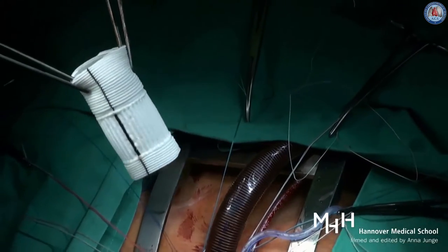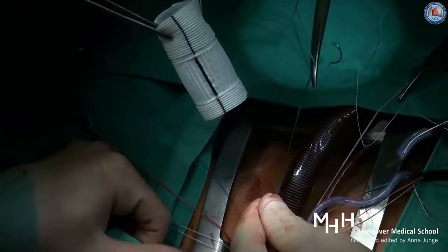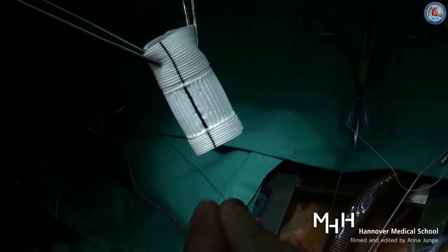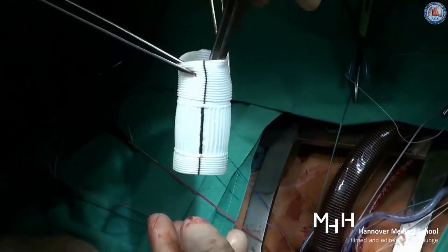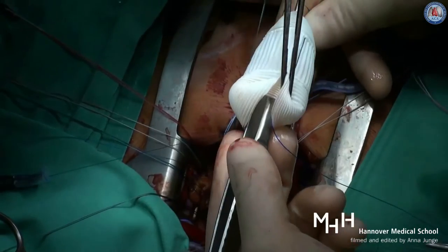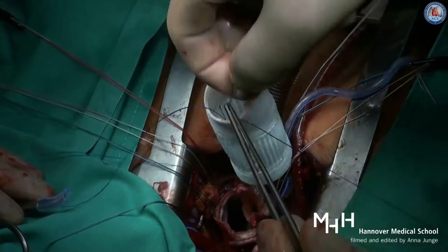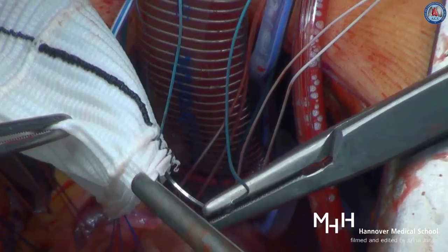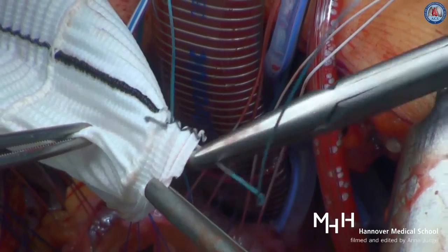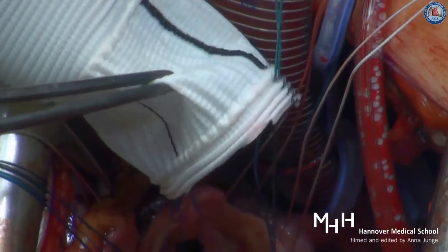If a straight tube graft is being used, the commissures are maximally pulled up without stretching the Dacron graft and then fixed to it. If a Valsalva graft is used, the commissures are re-implanted at the level of the neo-sinotubular junction.